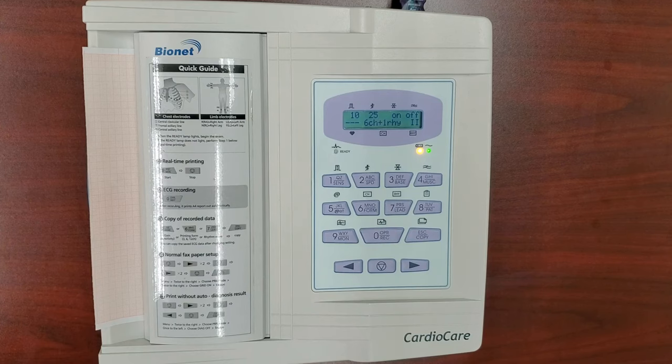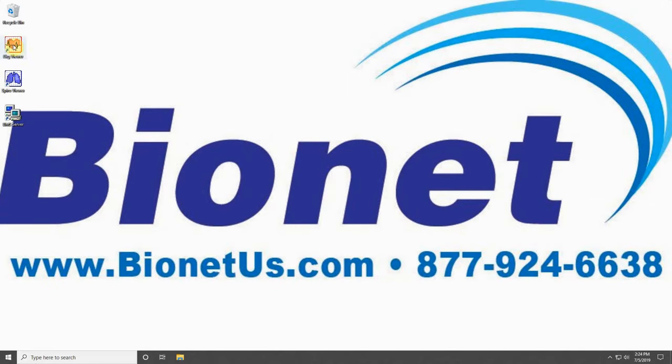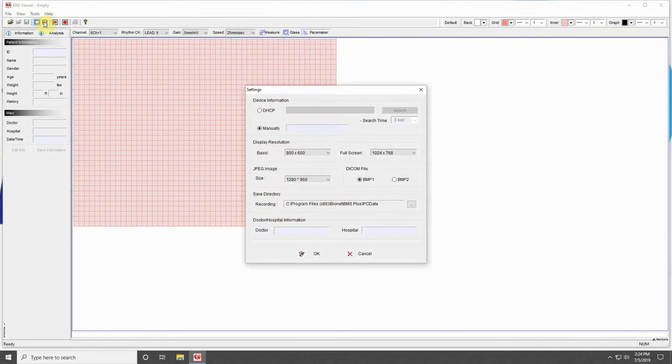Press the Escape button to exit the menu. Your CardioCare 2000 is now prepared to connect to your computer. On your computer, open your EKG viewer program. Click on Tools at the top, and then click on Settings. Click on Manually, and input your machine's IP address that you wrote down earlier. Now your computer has your machine's IP address, and your machine has your computer's IP address, which allows them to communicate.